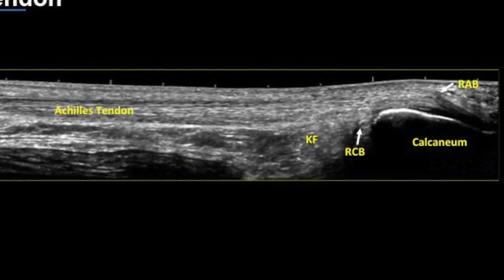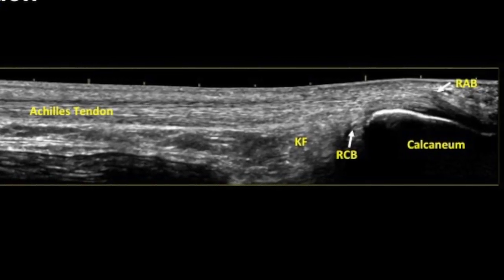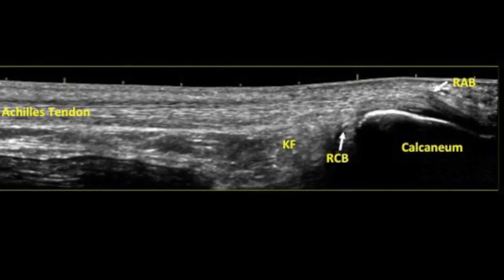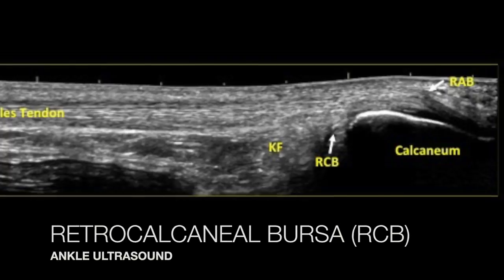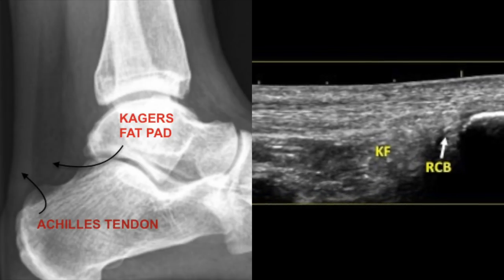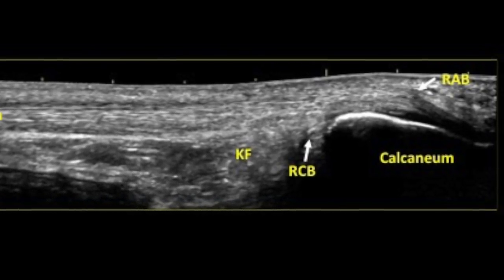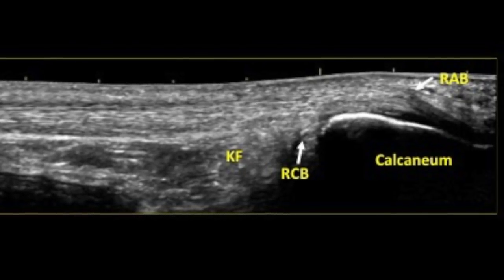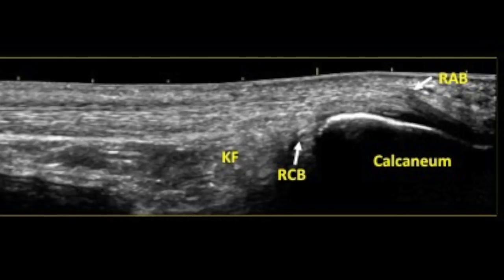Anterior to the tendon we see a comma-shaped hypoechoic structure nestled between the tendon and the calcaneum — this is known as the retrocalcaneal bursa. Just above this echogenic fat pad is the Kager's fat pad. Some amount of fluid is accepted within the retrocalcaneal bursa; in the presence of appropriate symptoms, fluid more than two millimeters in thickness is considered significant.